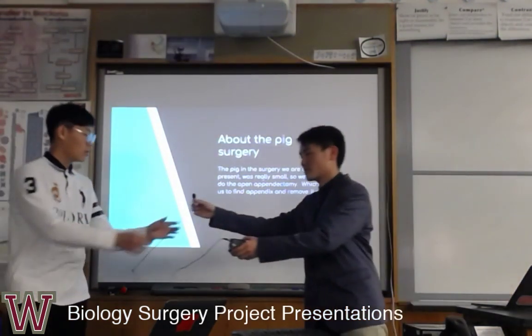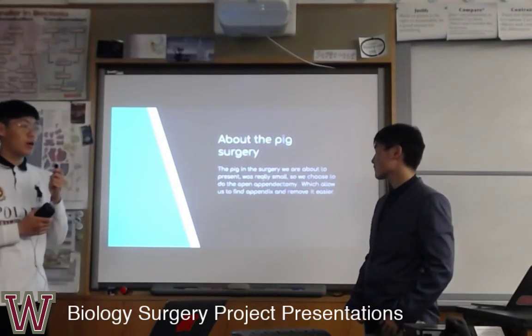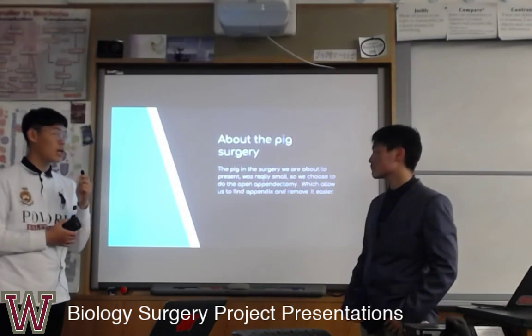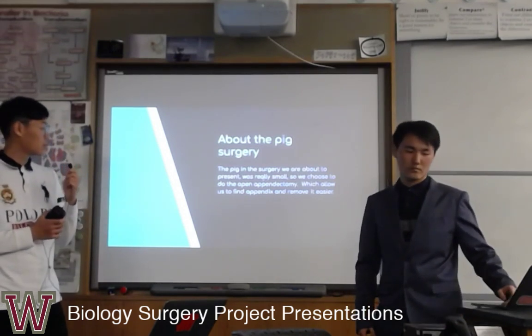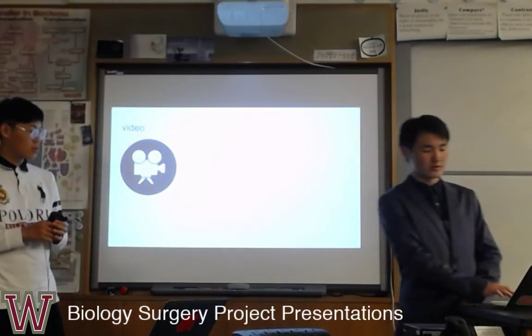The pig we're using in the surgery is really small, so we chose to do the open appendectomy, which allows us to more easily find and remove the appendix from the pig. And the video we are trying to show next is our surgery.